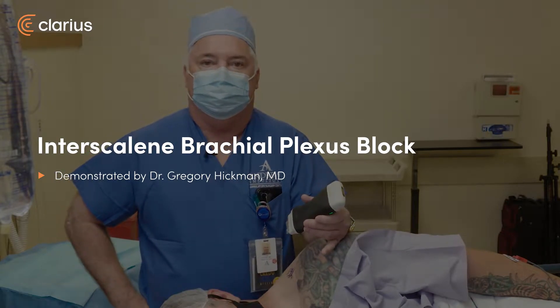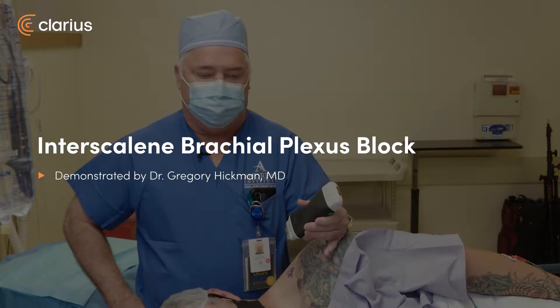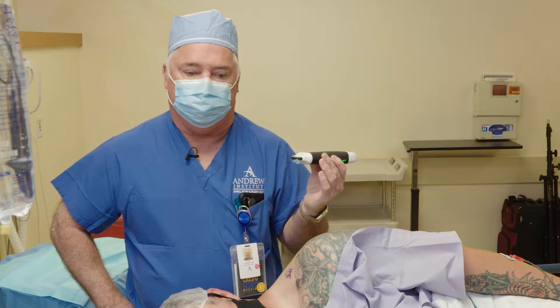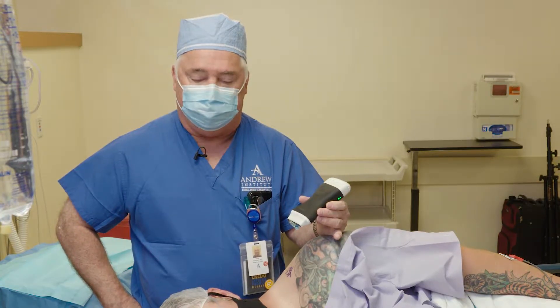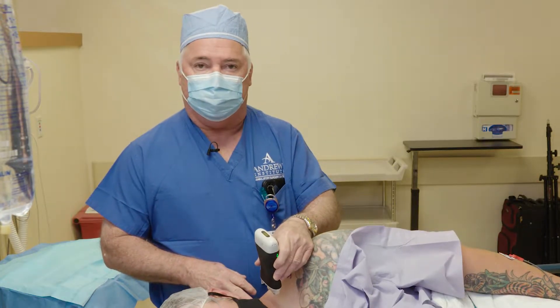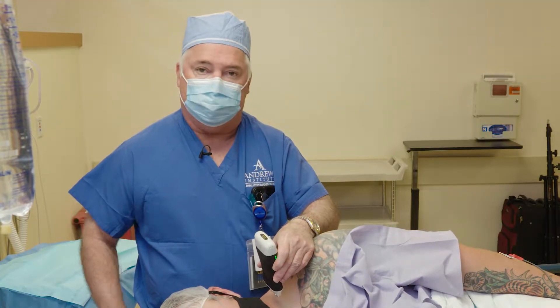This is Dr. Greg Hickman here at the Andrews Institute. We're going to do an interscalene catheter today for a young man having some shoulder surgery. We're going to use our Clarius to put our catheter in, and we'll show you how we do our approach. We're going to come in posteriorly and put the probe right over the interscalene brachial plexus right here in the neck.